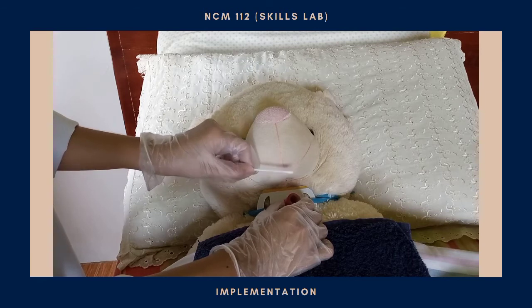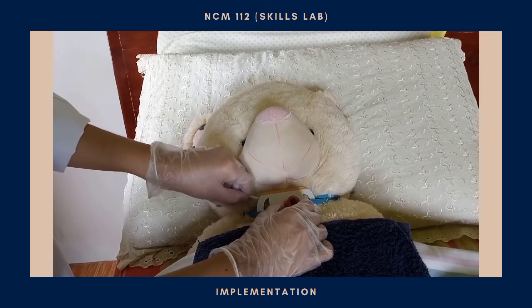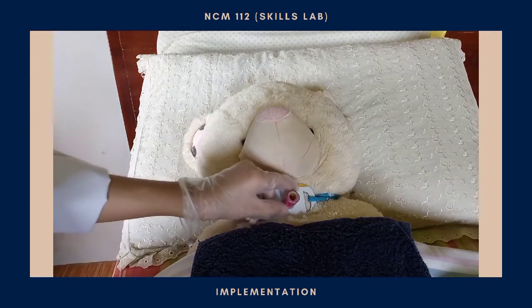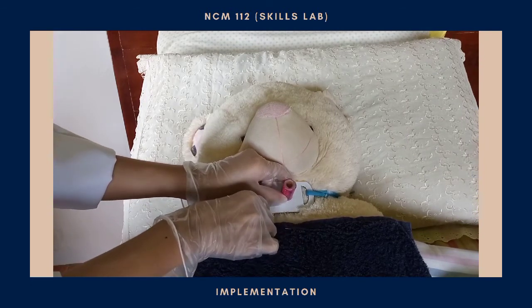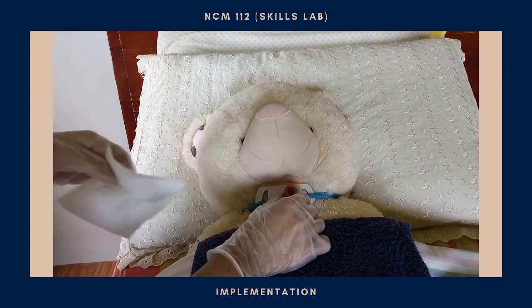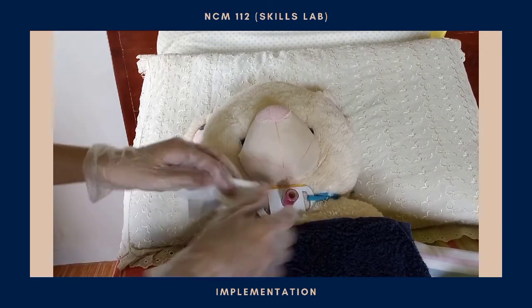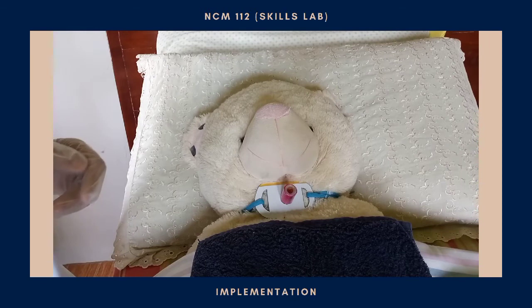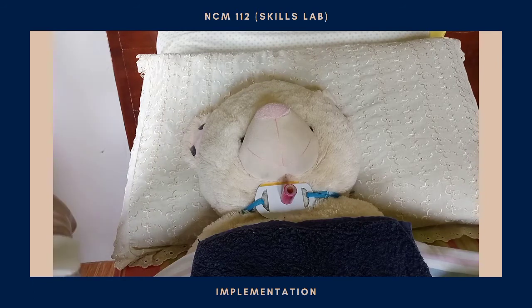I'm going to begin at the upper part of the tracheostomy, moving from the stoma side outward. Then discard, stabilize again, and move from the stoma side outward. Discard again. Pat the skin gently with a dry 4x4 gauze sponge and discard. We must ensure that the tracheostomy tie did not get wet when we clean the stoma site.